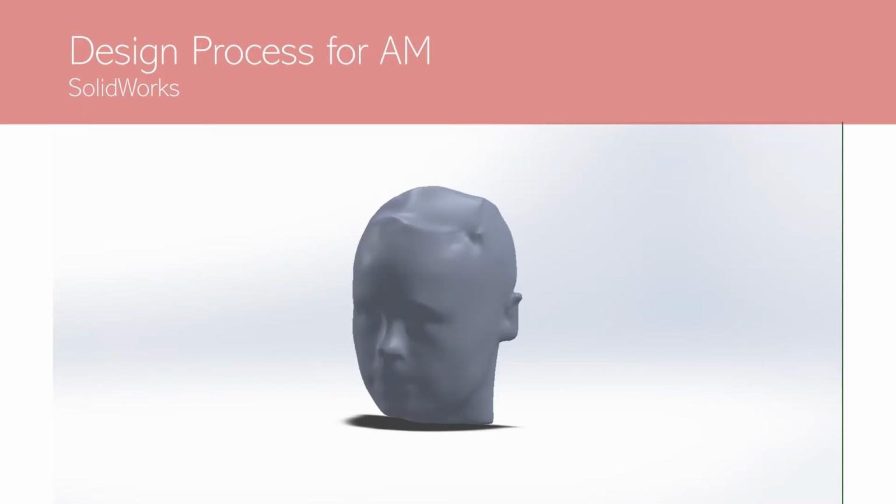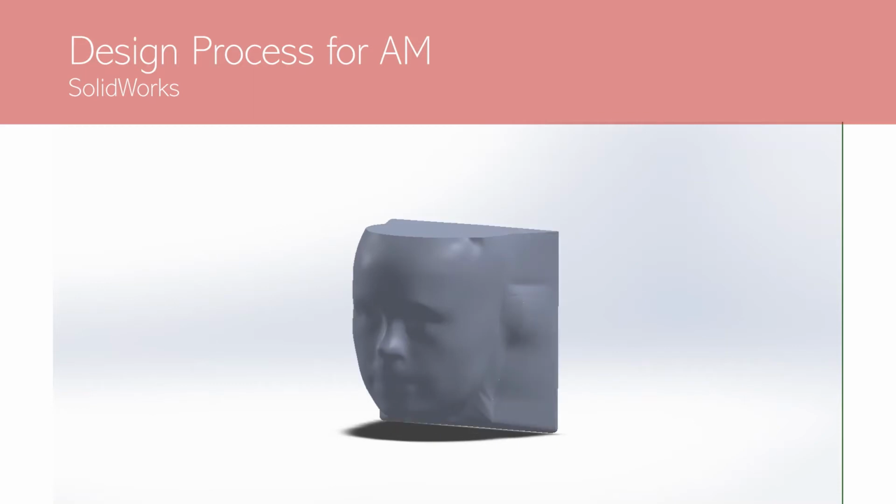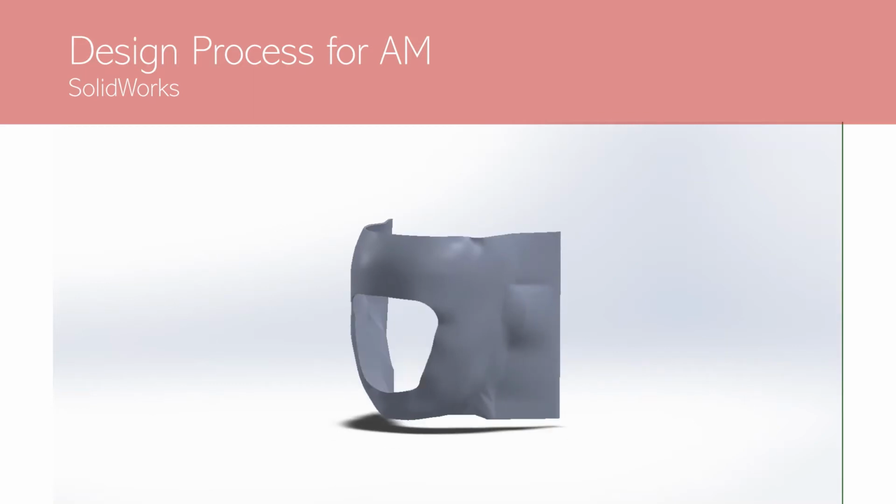The main CAD work was conducted in SolidWorks, where the B-rep model acted as a basis from which the mask design was produced. The interface of how the mask fixes to the treatment table during radiotherapy was created, along with a cutout around the facial features to help reduce anxiety experienced during treatment.